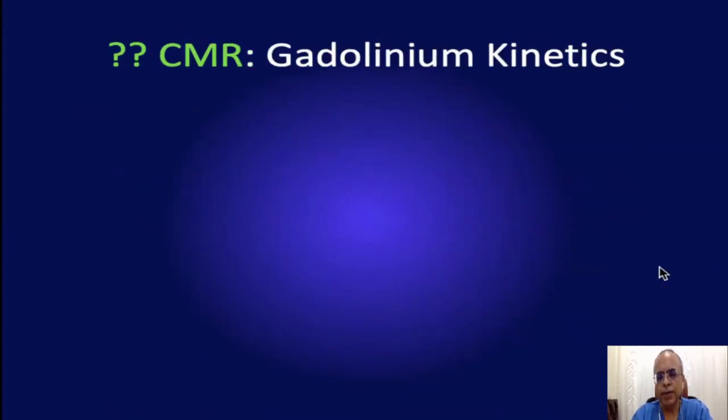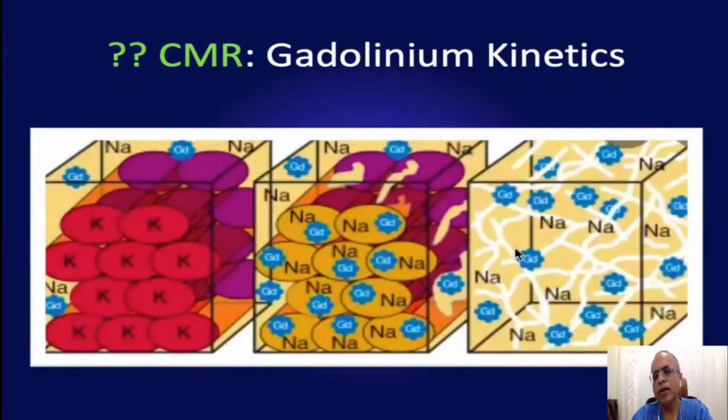And what about the gadolinium? You must have heard this jargon of late gadolinium enhancement. Gadolinium gets out of the capillaries into the extracellular volume. In normal myocardium, it cannot enter the myocytes, the extracellular volume is small, and there are good capillaries, so the gadolinium gets washed out. However, if the myocardium is necrosed, the gadolinium can enter the myocardium. Also, if there is a lot of extracellular edema, fibrosis, inflammation, exudation or infiltration, there will be a large space in which the gadolinium can diffuse, and it will not get cleared. That is what we call late gadolinium enhancement, or the late gadolinium signals.